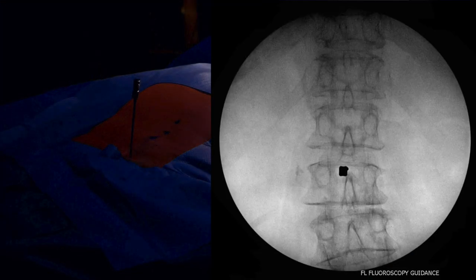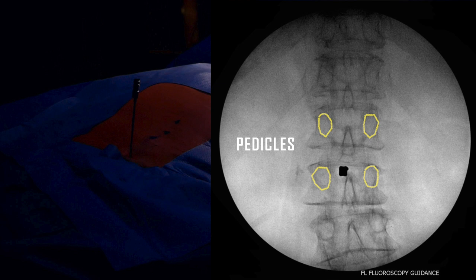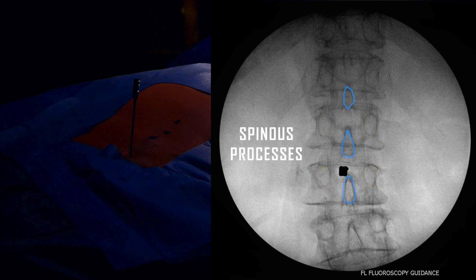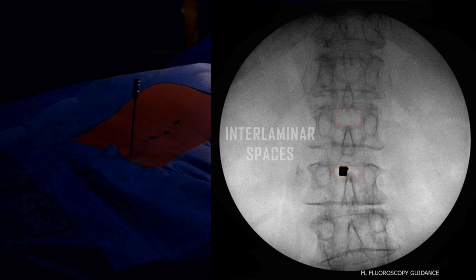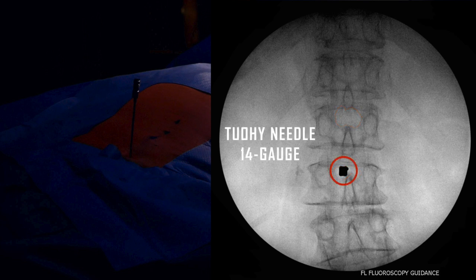Key anatomy to identify includes the pedicles, spinous processes, lamina, and interlaminar spaces. The needle should also be identified and should be coaxial in this view.